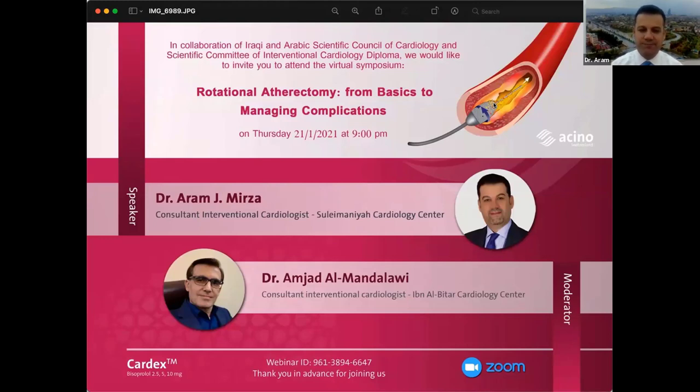The other question: is there any role for IVUS or OCT for optimizing the use of rotational atherectomy, like in the case of third degree calcification, or any role for that? The same role as for ordinary PCI. If you want to optimize your result, or if you're sure that your result is good, it's the same indication. There is no special indication. It's the same as ordinary PCI. Yes. Okay, thank you very much.